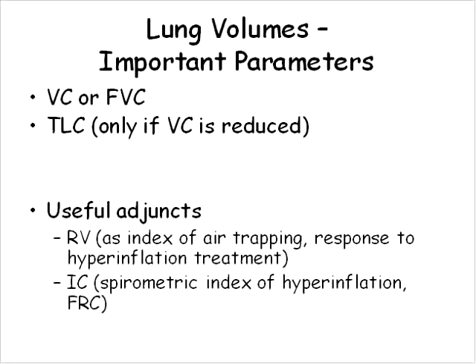Inspiratory capacity has been shown in some studies to relate to whether or not the patient is hyperinflated, whether that hyperinflation is responsive to bronchodilator therapy, and also to help decide on the prognosis for patients who have very severe obstructive lung disease.